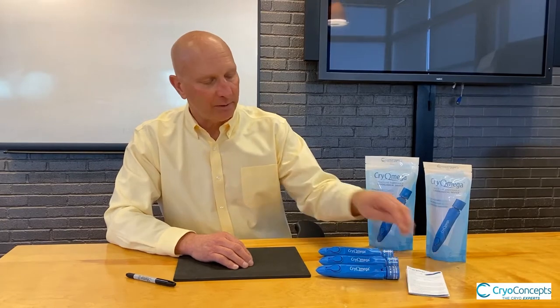In this section, I'd like to show you how to activate and operate the Cryomega cryosurgical device. It's really very simple. After removing it from the packaging, you'll notice that there's an instructions for use, which should always be reviewed.